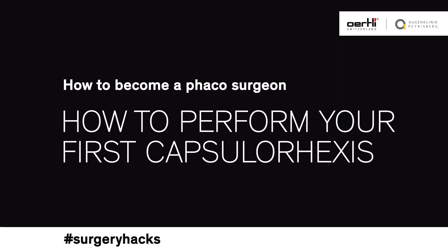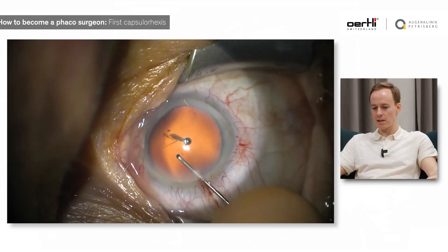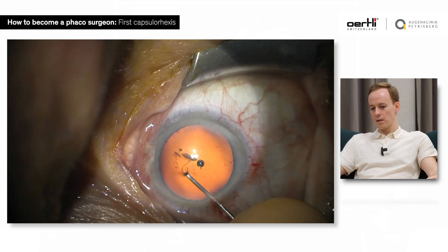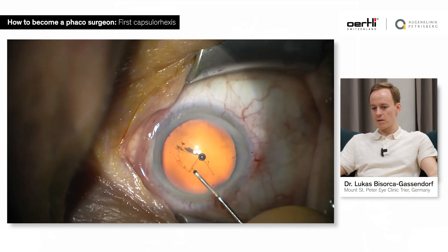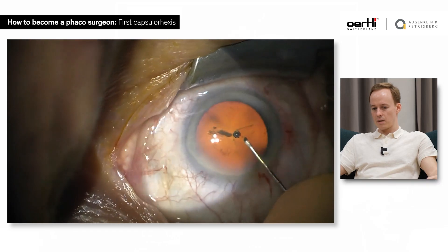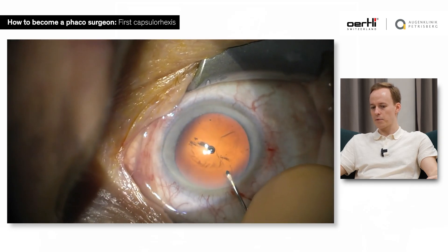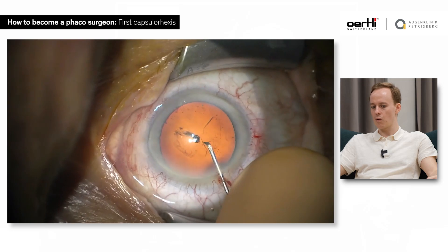You've managed the first steps in the OR — you can do a tunnel now, you could do side port management — and now we're going down to the heavy stuff. We do the complete capsulorrhexis with the cystotome via the superior paracentesis. I think I started doing capsulorrhexis after two or three weeks in the OR.